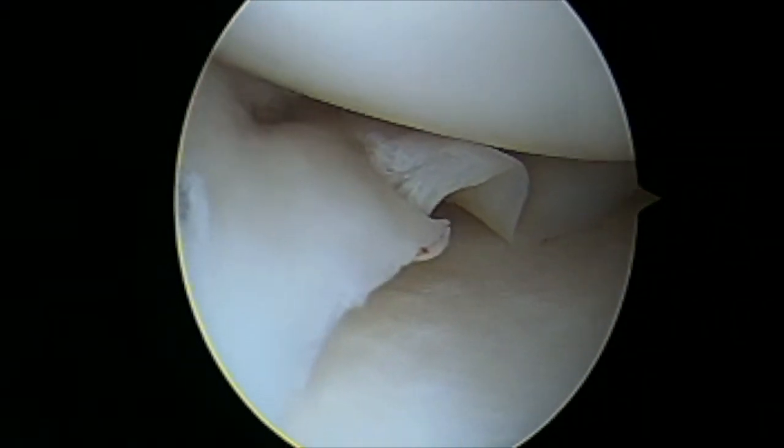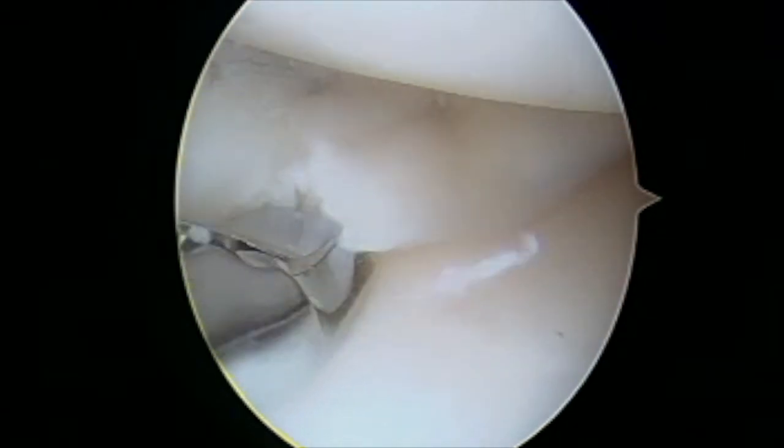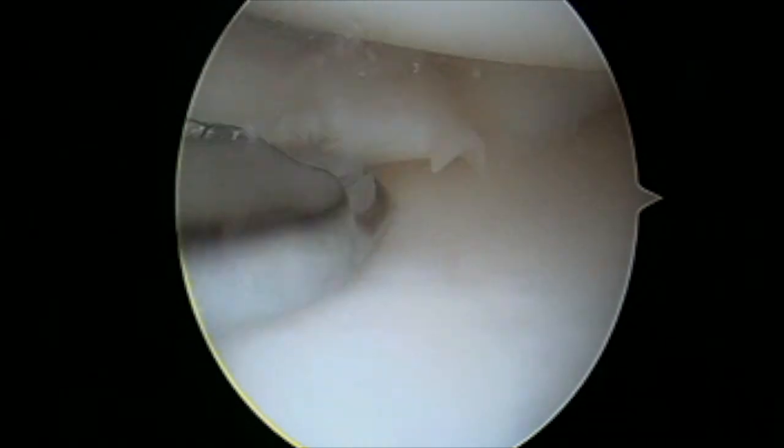Here I am firing some final sutures. This patient also has a small radial split, and I am using a basket biter to debride this split tear and then a shaver to remove any meniscus fragments.